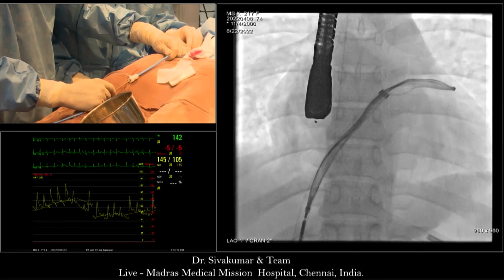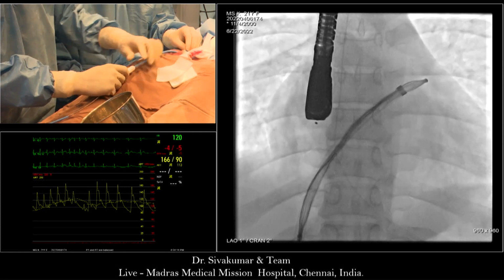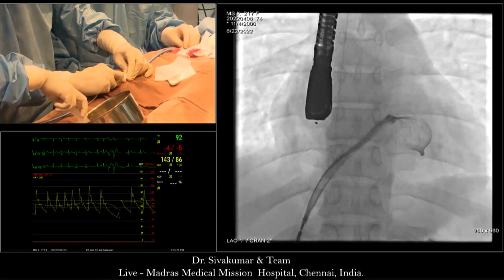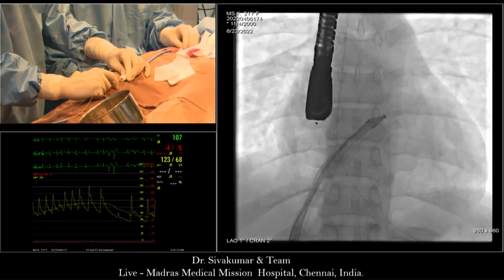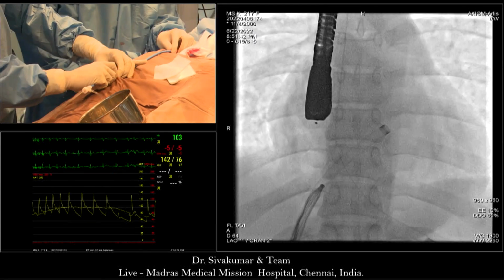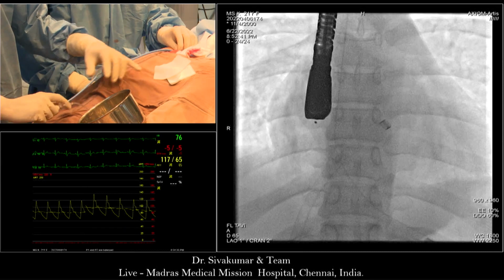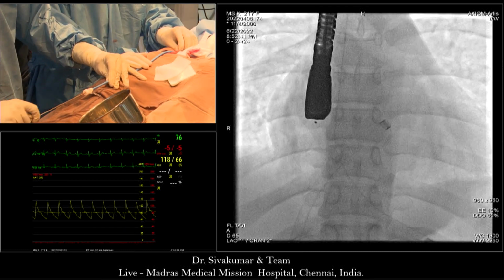I will recapture this one. He's deploying, so let's have a quick look at what's happening. That's what you were saying, Barak. It was a bit too deep. It wasn't releasing. But he's in the lower segment of the left, not the Cobra. Yes, it's a Cobra. I will set it right. Actually, I should have chosen a left upper, but it was entering the left lower and I just accepted it.